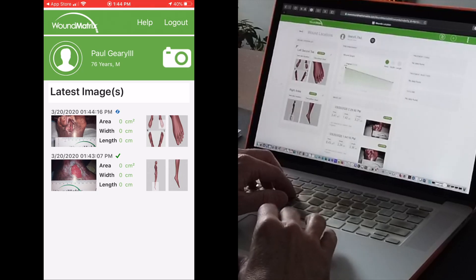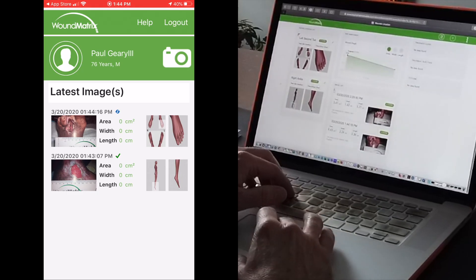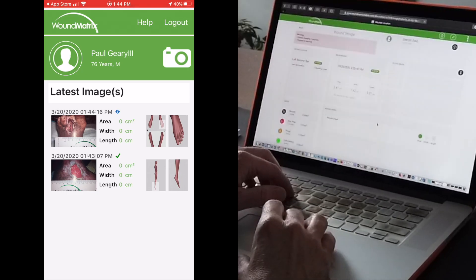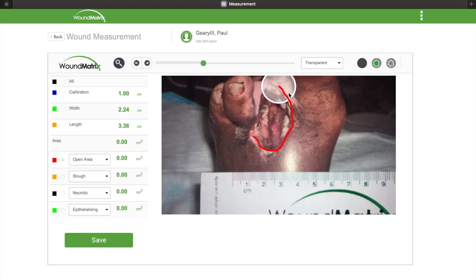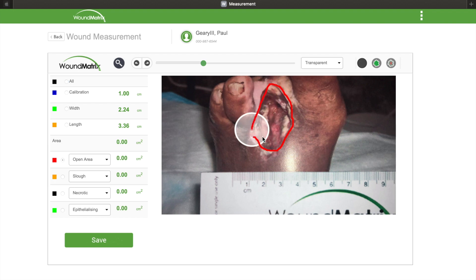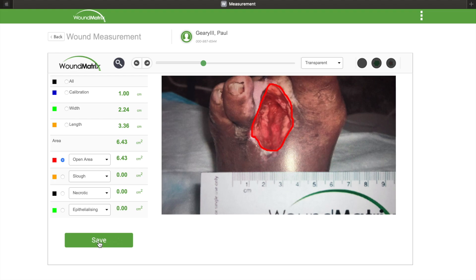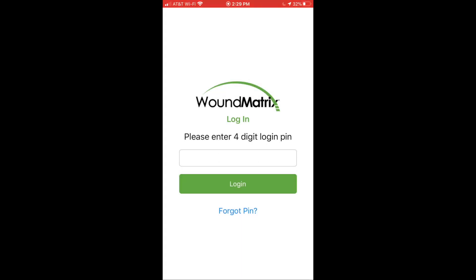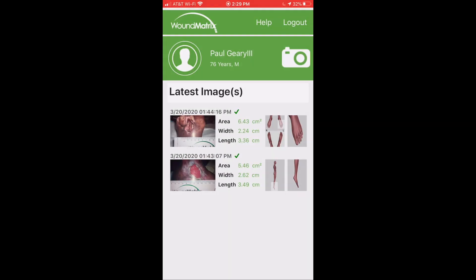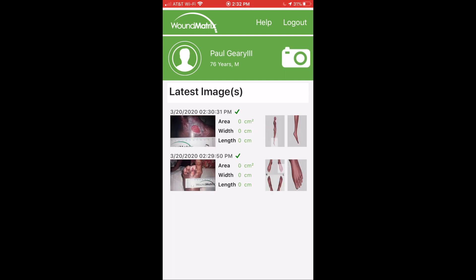Pictures instantly upload from your phone to your provider for assessment and review, and allow providers to perform instant surface area wound measurements. Each time a user logs back in, they may view their wound measurements for all wound locations.